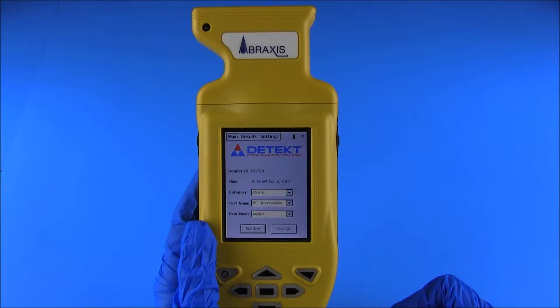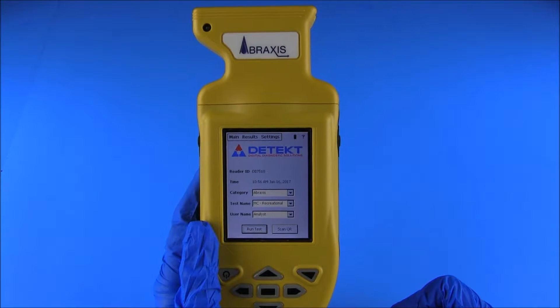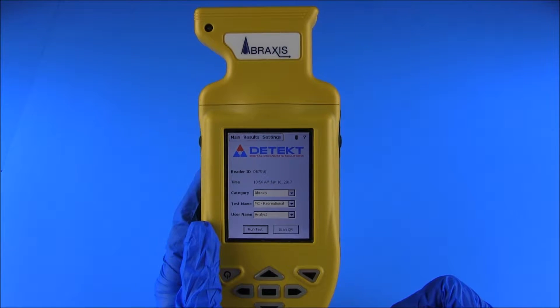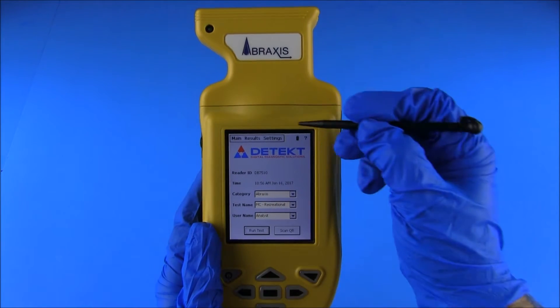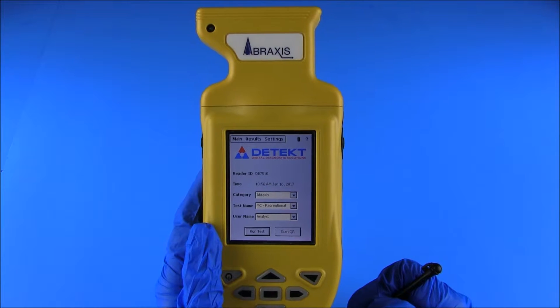The user control menu is located in the top left area of the touch screen and displays three menu options: main, results, and settings. When the AbraScan reader is powered on, the main menu will be displayed. Return to the main menu at any time by selecting the main tab.